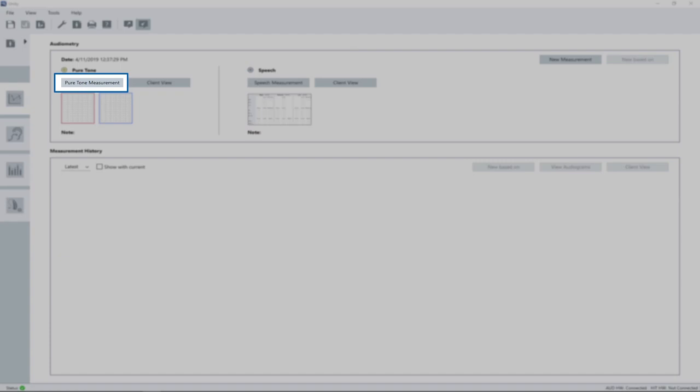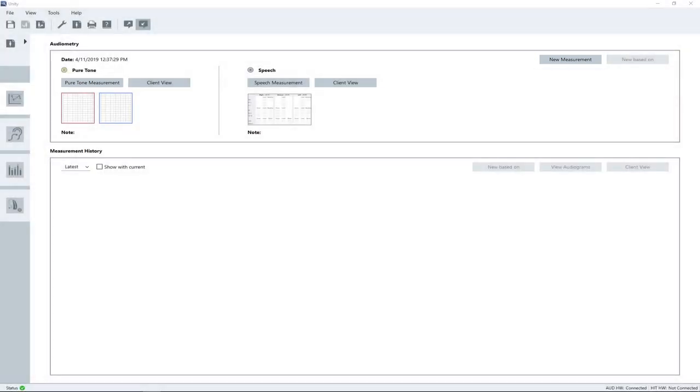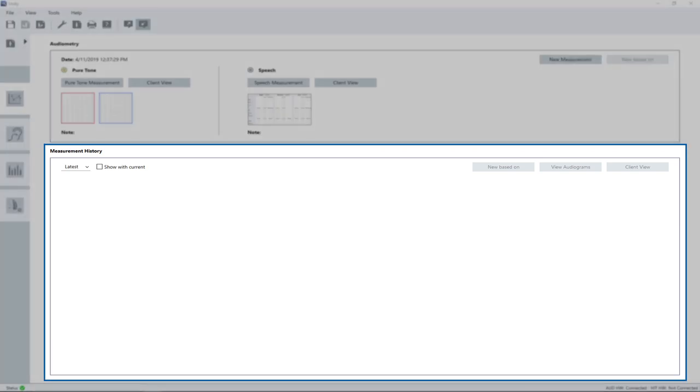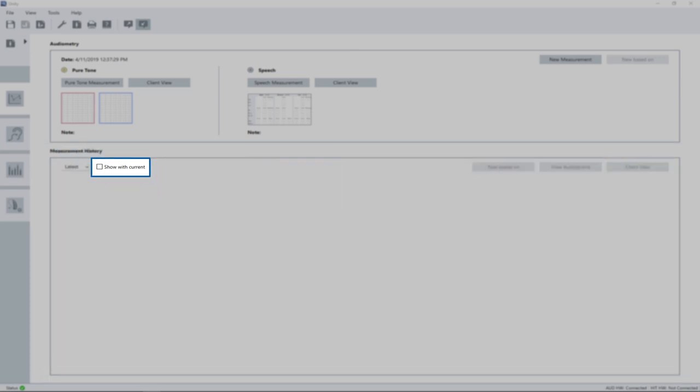In case you want to start with a clean and empty grid, click the new measurement button prior to opening the measurement window. To open an existing measurement from the session list, double click on it and it will open automatically. To display an older measurement together with the new audiogram, select the older one from the session list and mark the checkbox Show with Current before opening the audiometer workspace.